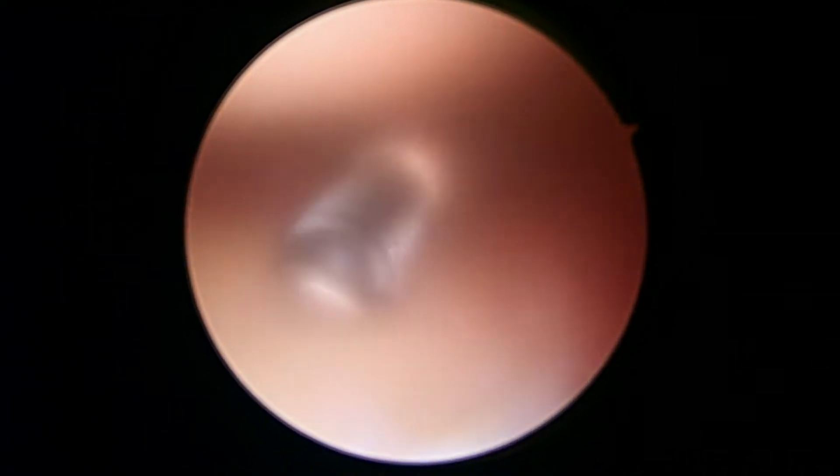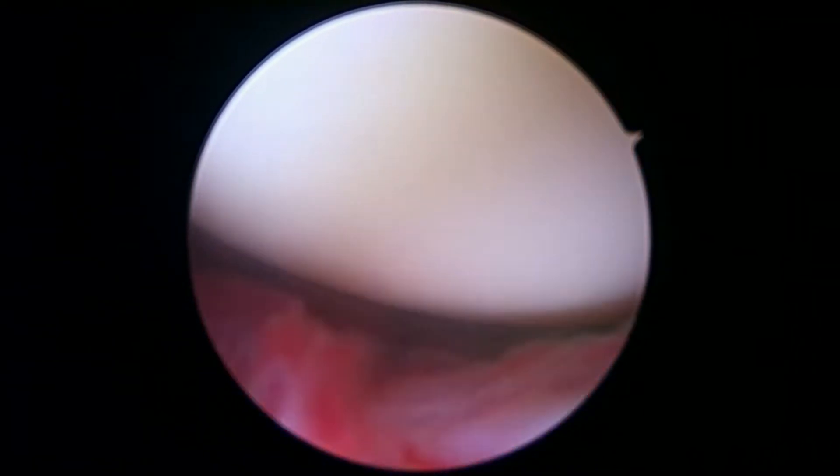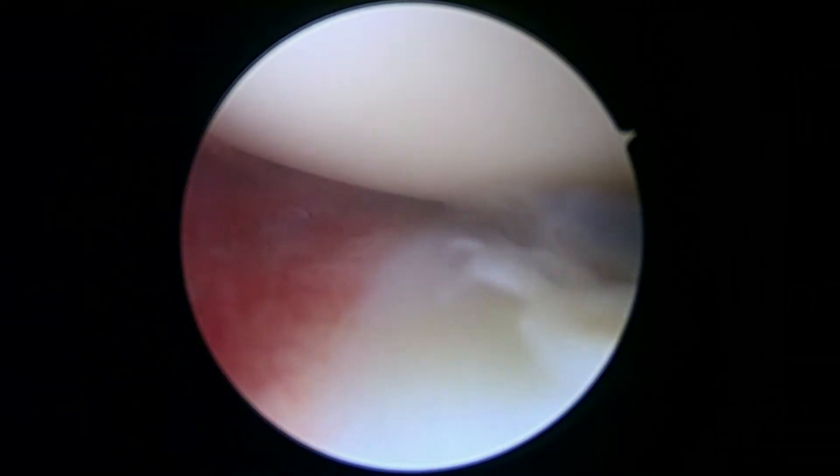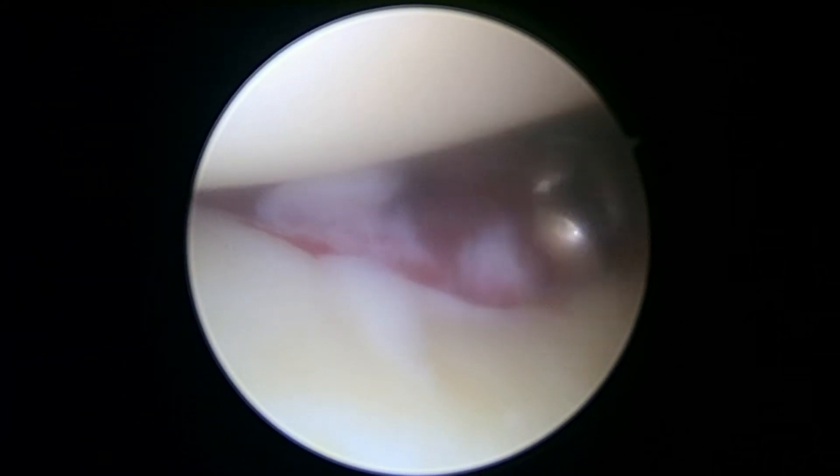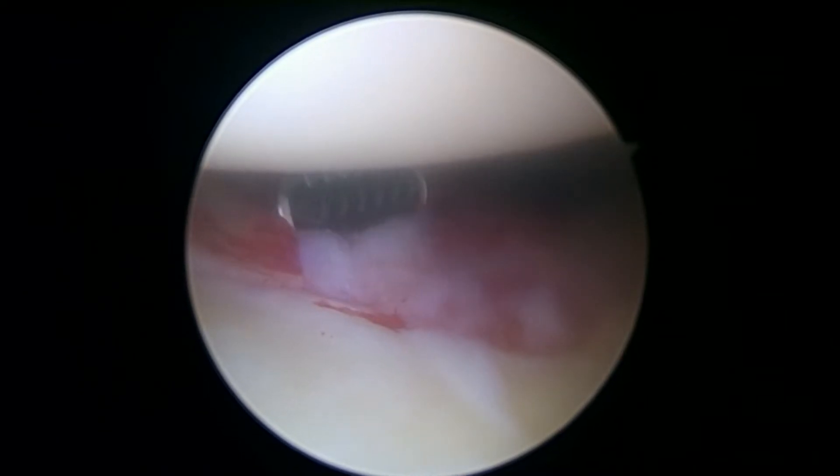Sorry, it's a little bit cloudy, but we're just using suction to clear out the picture. As we look towards the back of the shoulder, other than the redness, there's really nothing else to worry about back here. And as we look down the front, we had that anterior labrum. In general, the rest of that looks fine. So we'll keep working here.